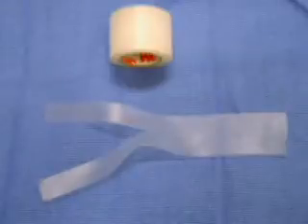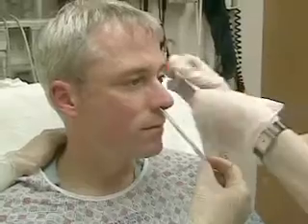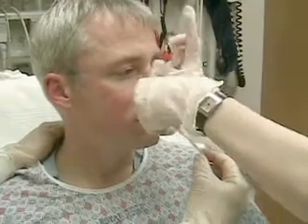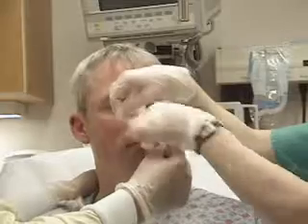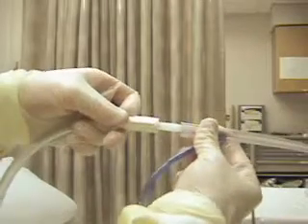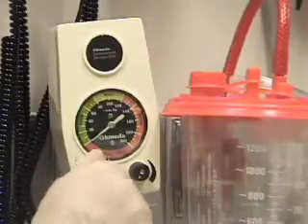Take a 5 to 7 centimeter strip of adhesive tape and tear it vertically for 1/2 of its length. The wide section is placed across the patient's nose and the two tails are then wrapped in opposite directions around the NG tube. You may now connect the nasogastric tube to suction. Turn on the suction and adjust the vacuum force as desired.